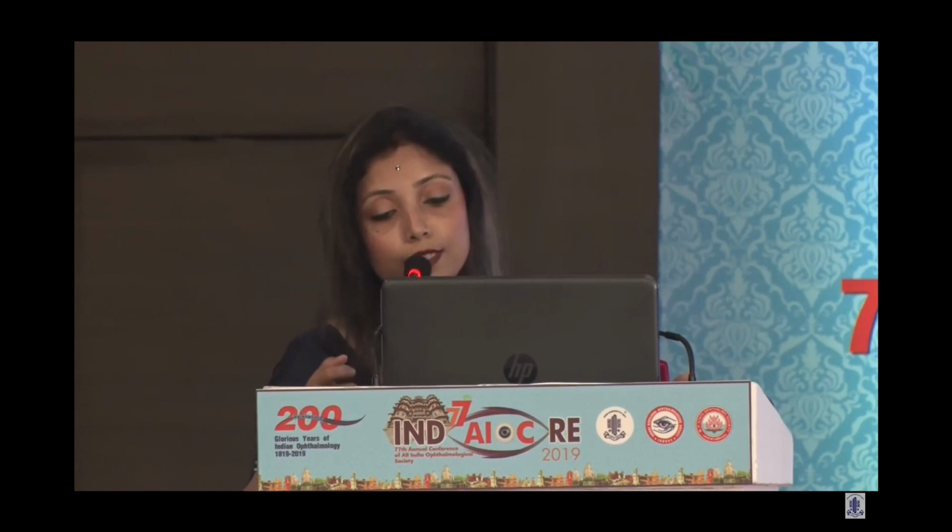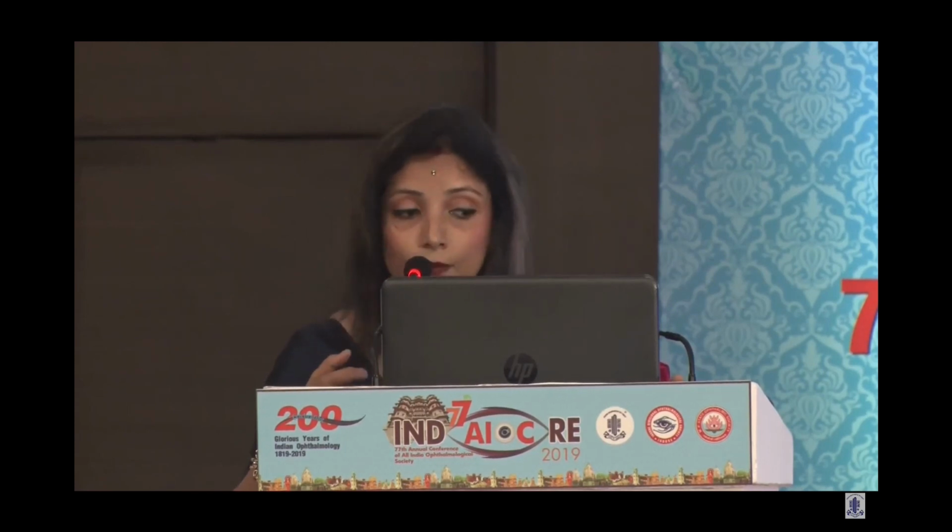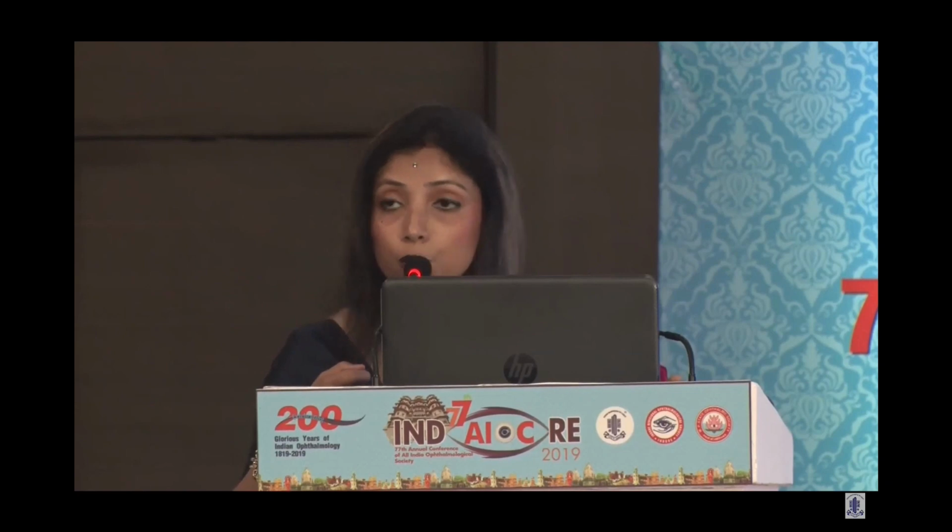We do the cleaning with a 3-bucket approach, where the first bucket contains the water, the second one contains an antiseptic solution, and the third bucket contains Bacillocid. This is the cleaning protocol. The roof is cleaned 3 monthly, wall and floor daily. The refrigerator should be cleaned weekly. The sink and all the OT furniture will be cleaned daily, and the HEPA filters will be cleaned 3 monthly.